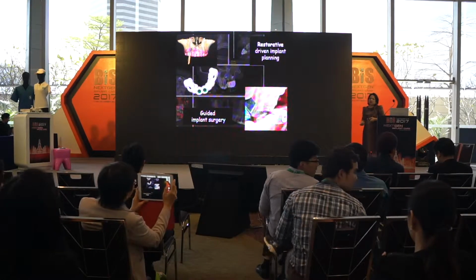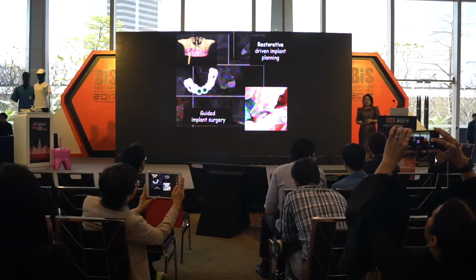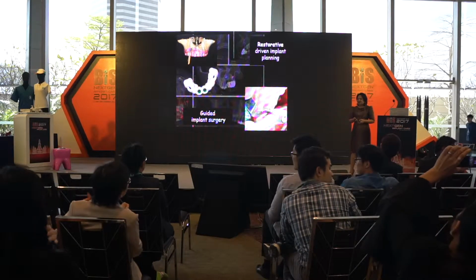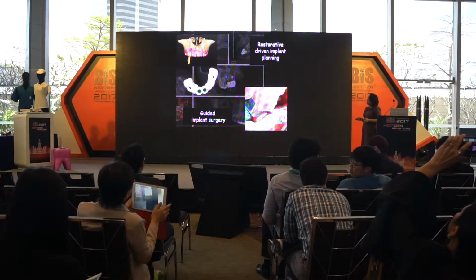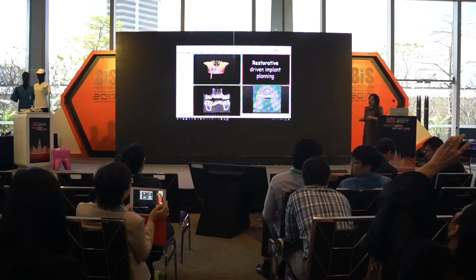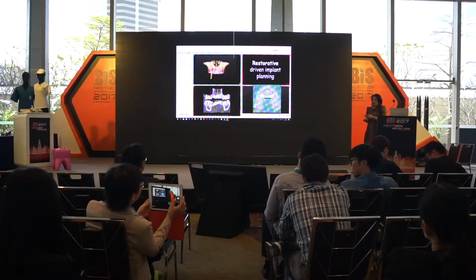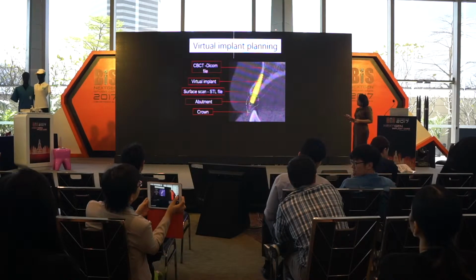Guided surgery is the process of planning and then transferring that plan to the surgeon by using a customized surgical template. Guided surgery is restorative-driven implant planning. For the data, we use the surface scan combined with the CBCT, and then we generate the surgical template. This is the data for guided surgery.